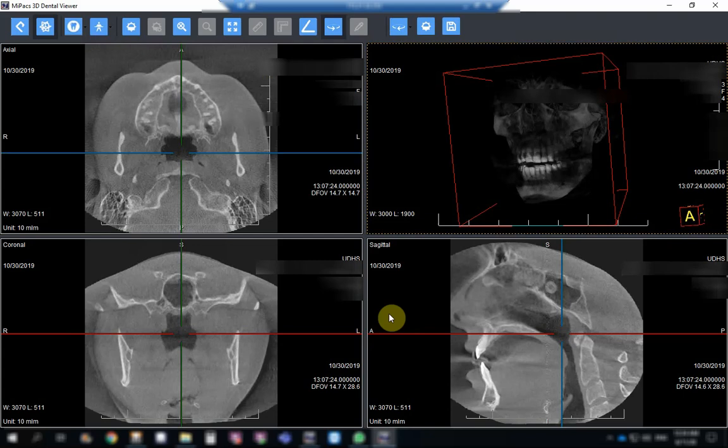Welcome everybody to a new presentation in which we are going to have a look at another system that displays 3D CBCT images. As you know, now in the market there are several softwares — it could either be proprietary to the x-ray machine itself, so you view it only in the x-ray machine, or there are softwares you can find online where you can import DICOM images taken in another machine and view them.